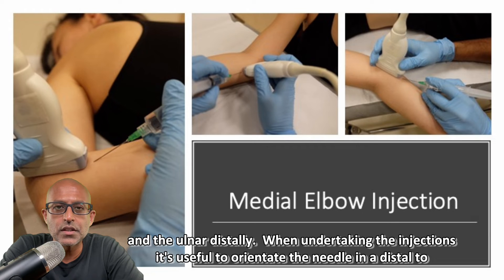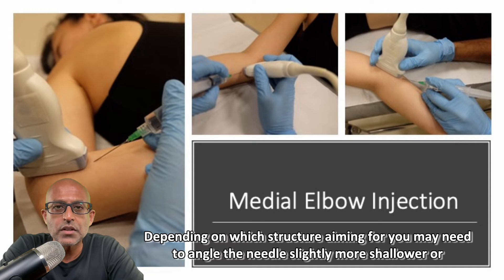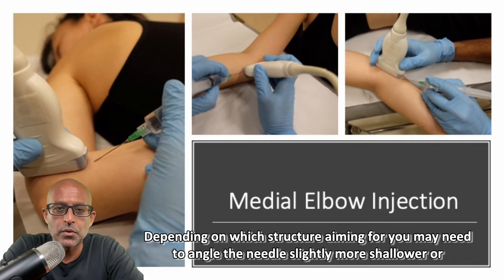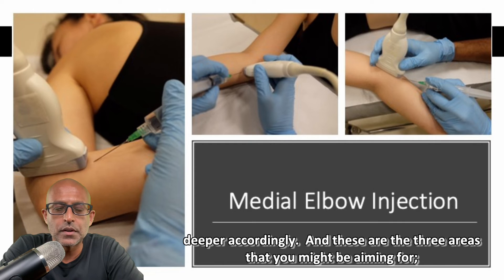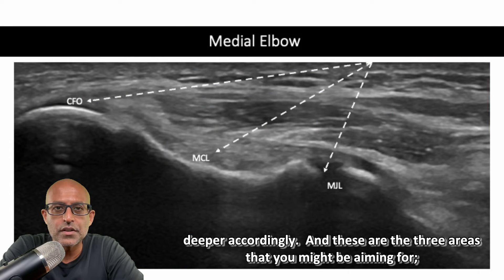When undertaking the injections, it's useful to orientate the needle in a distal to proximal orientation. Depending on which structure you're aiming for, you may need to angle the needle slightly more shallower or deeper accordingly. And these are the three areas that you might be aiming for.